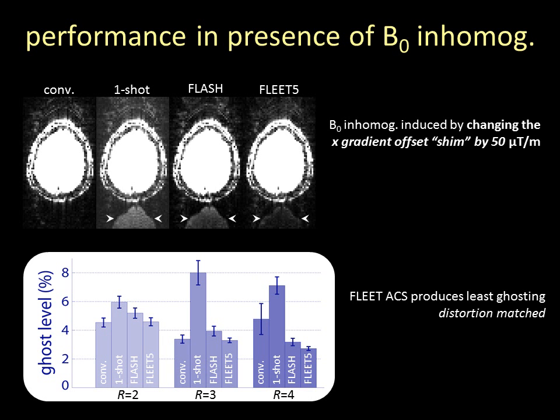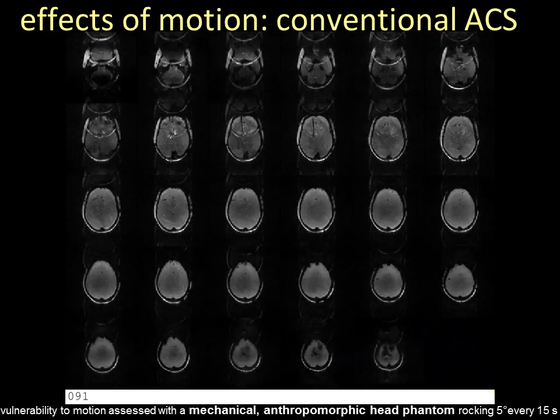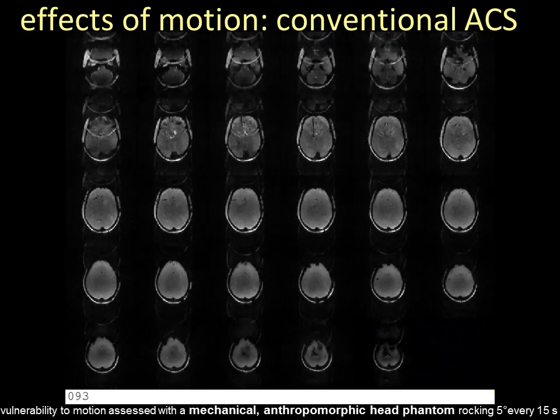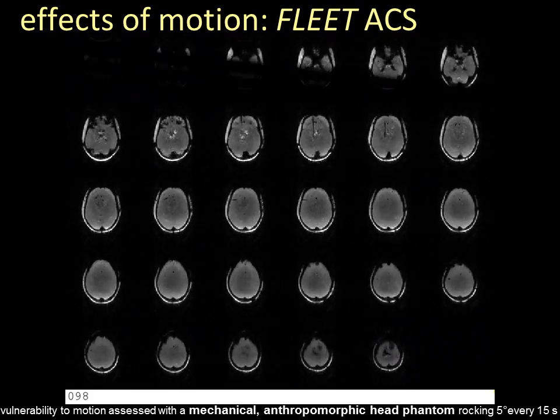So here's a comparison of the performance of various ACS methods in the presence of B0 inhomogeneity. Unlike single-shot ACS or FLASH ACS, the FLEET ACS is distortion matched to the accelerated EPI data, and therefore produces the lowest ghosting levels in the presence of B0 inhomogeneity. To demonstrate the effects of motion during ACS acquisition, we constructed an anthropomorphic head phantom and rocked it during the ACS acquisition. When using conventional multishot EPI ACS, we see strong aliasing artifacts in the image reconstructions. However, when we use a FLEET ACS acquisition and reconstruct the same data, the aliasing artifact is removed, showing this motion insensitivity of FLEET ACS.